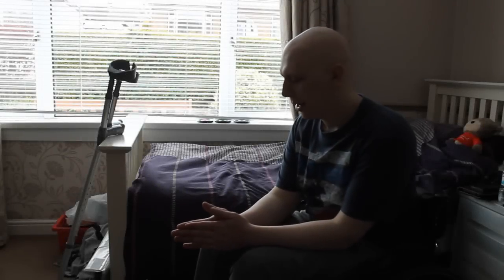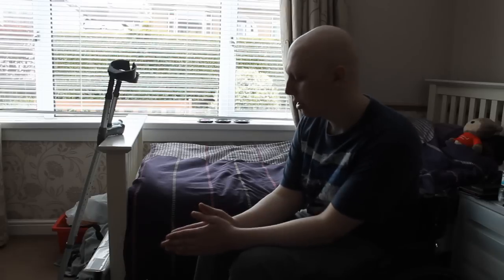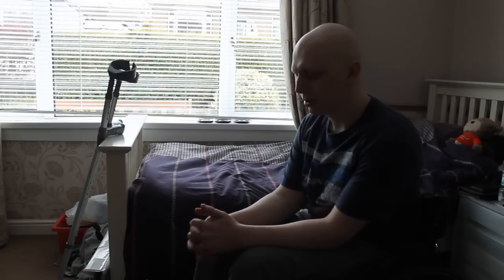Today I'm making this video on AFO leg splints. Leg splints are good for supporting your ankles and your feet when you're walking.